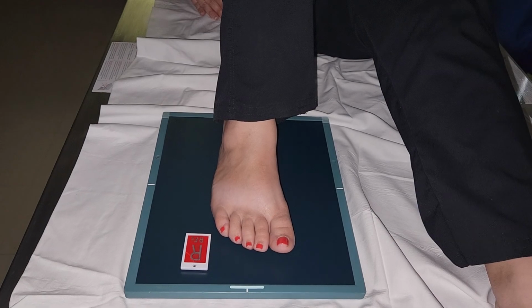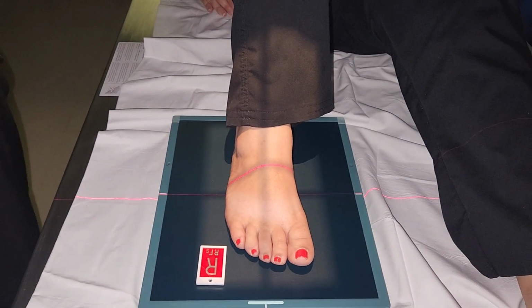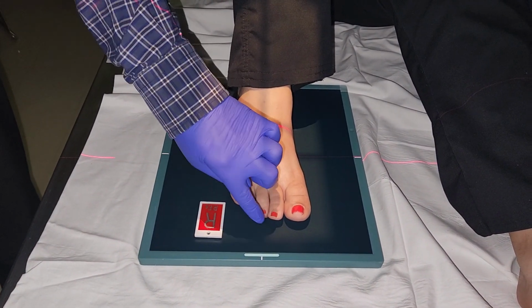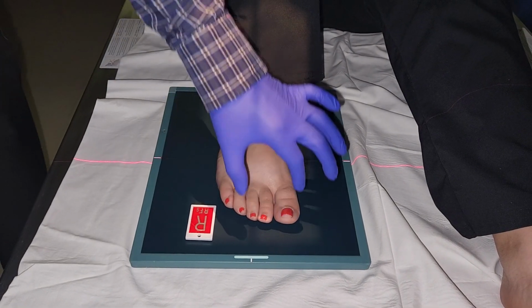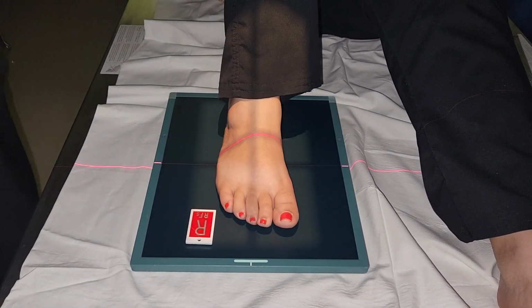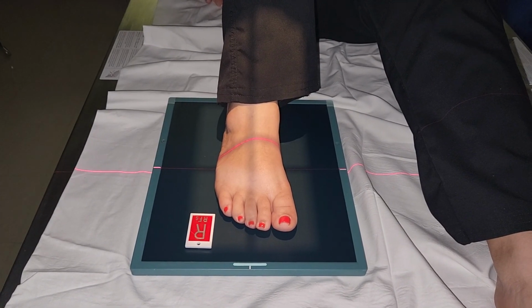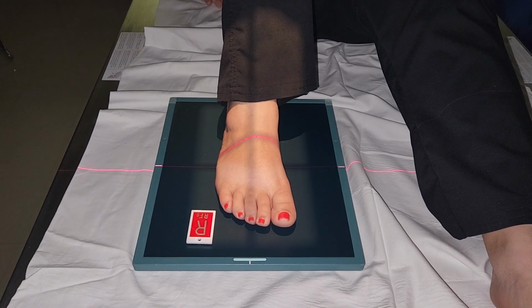Marker always goes on the lateral side, but more than that, you see how the toes kind of curve away this way? It gives you this nice triangle where you can squeeze your marker in, right? There's no point trying to force your marker here by the big toe because it's using up all the space. So put it over here in the corner. All right, great. Any questions on AP foot?